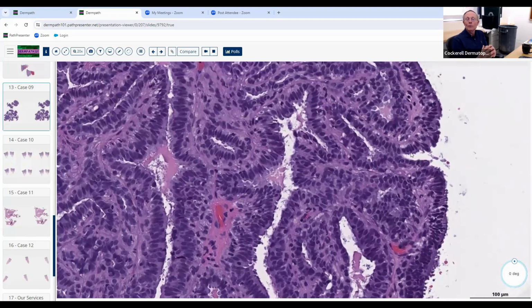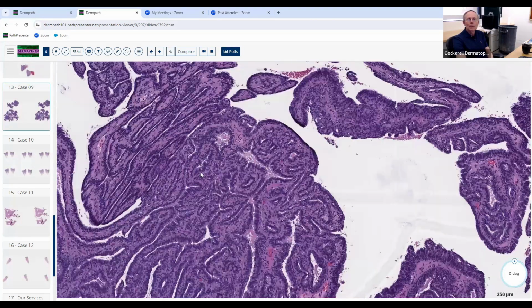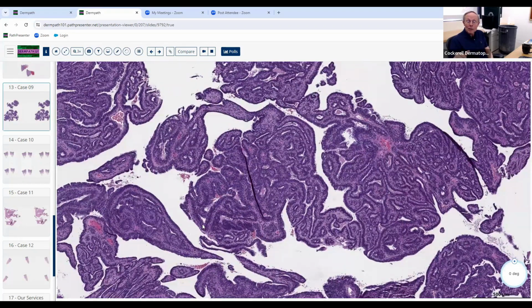So we know we're now in the family of apocrine lesions. And there's not too many of those that you need to know about either. For example, if it's a cyst-like lesion that's inverted, we think about so-called Hidradenoma Papilliferum. If it's an exophytic lesion that's on the scalp, we think of Syringocystadenoma Papilliferum. So those are basically the same lesion. One's sort of external and one's kind of internal.